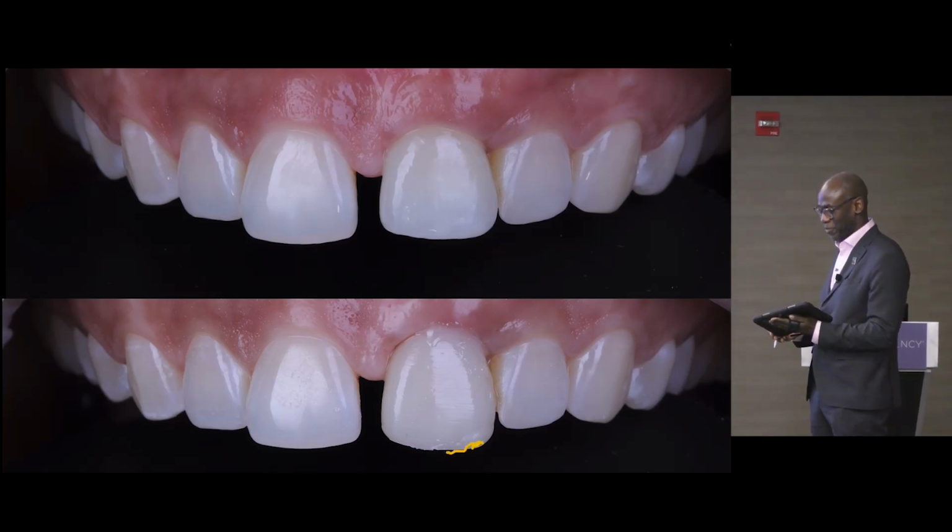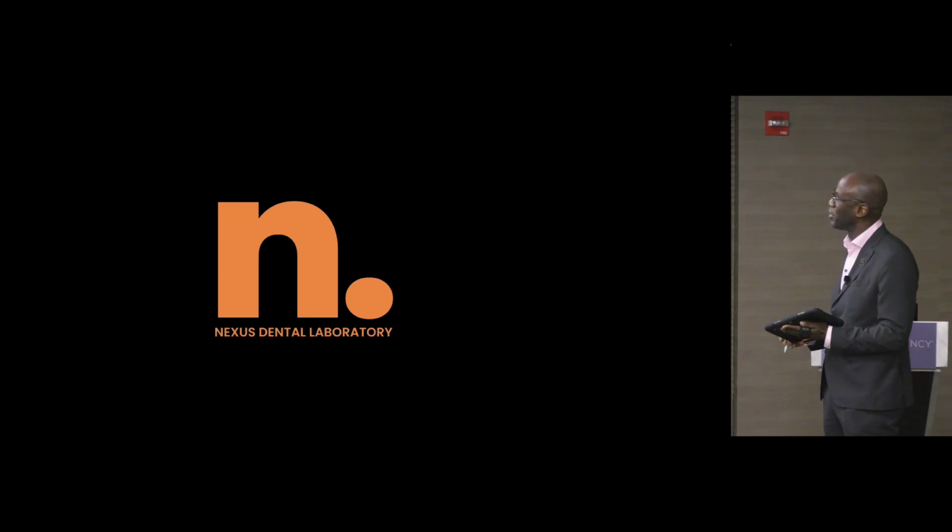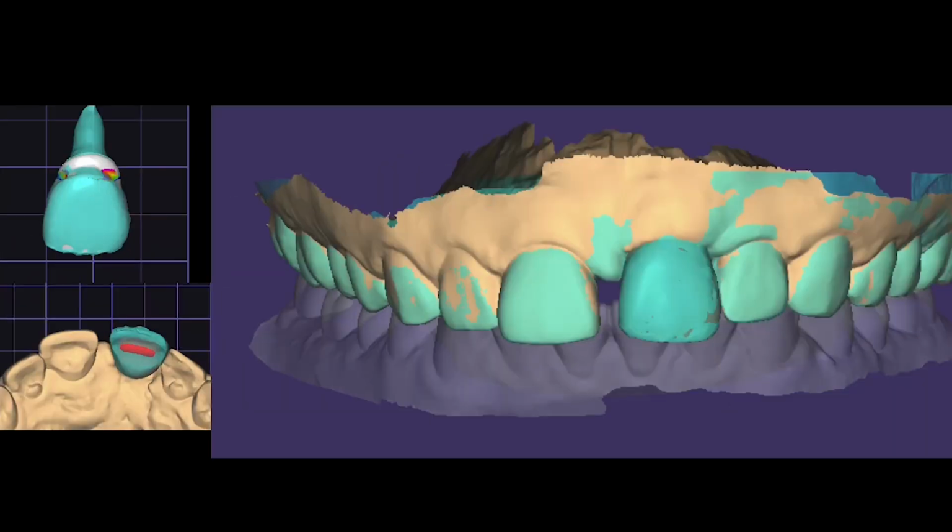This is why I want it. Then I hand over to Steve, and he literally, here you go. Clone it. And this is coming back to the communication we spoke about in the beginning, because now that we've got that, we import it in, and I'm literally going to clone it. So he's not having to explain it or draw it in a bit of thing. He's literally added a bit of composite, scan it, send it to me.